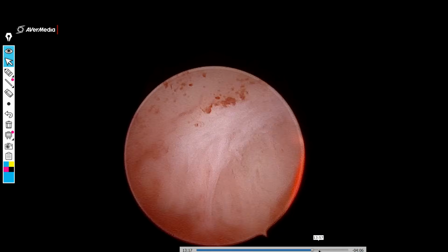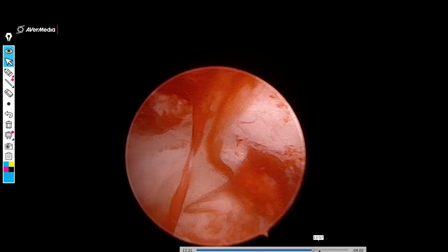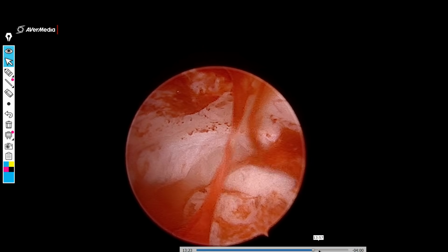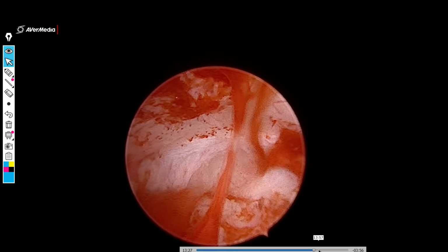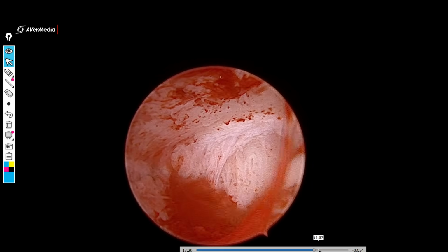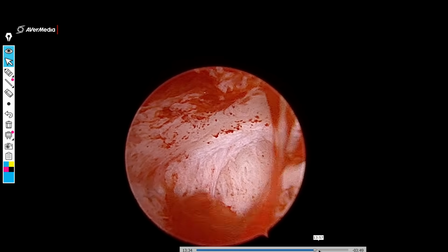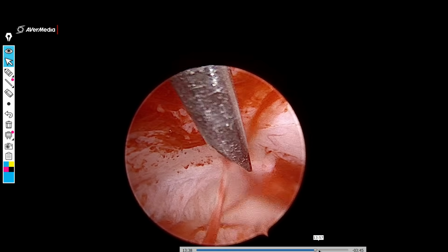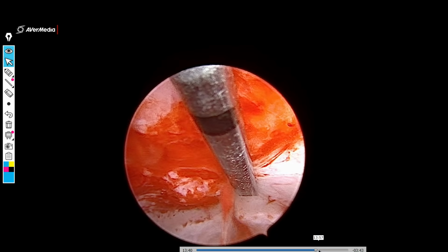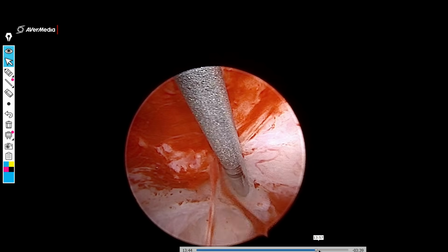However, one more step is left, and this is what we've been doing now for quite a few patients. Some patients have very good results, some patients not so much, and some IVF specialists literally vouch for this therapy. So, for the cost, for the possibility of being able to give the patient maximum benefit, we do not really know whether it will work tremendously well or not. This is what we are doing, and this is subendometrial PRP injection.